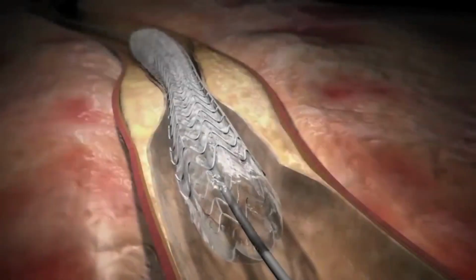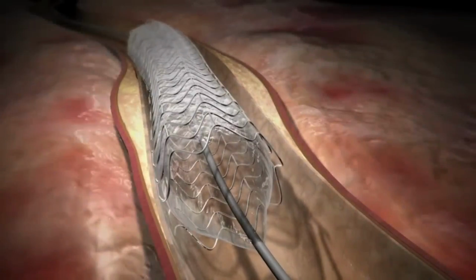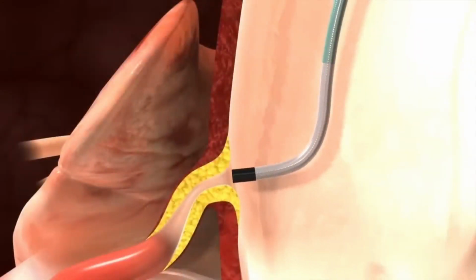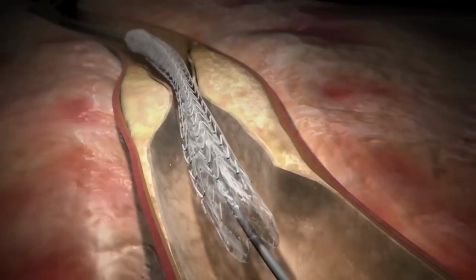An angioplasty is a procedure that opens up blocked blood vessels without surgery. During the procedure, the cardiologist places a sheath into an artery in your groin or wrist. The cardiologist will guide a small catheter into the coronary arteries through this sheath.